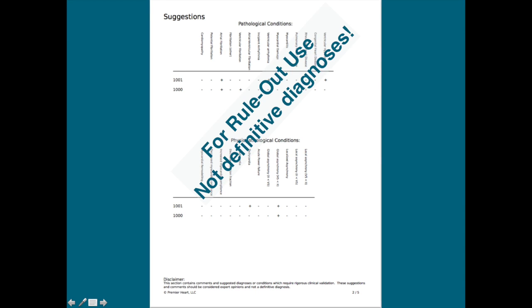However, we must make this clear. These are recommendations for further investigation and confirmation. This should not be considered as a definitive diagnosis that can be taken at face value.